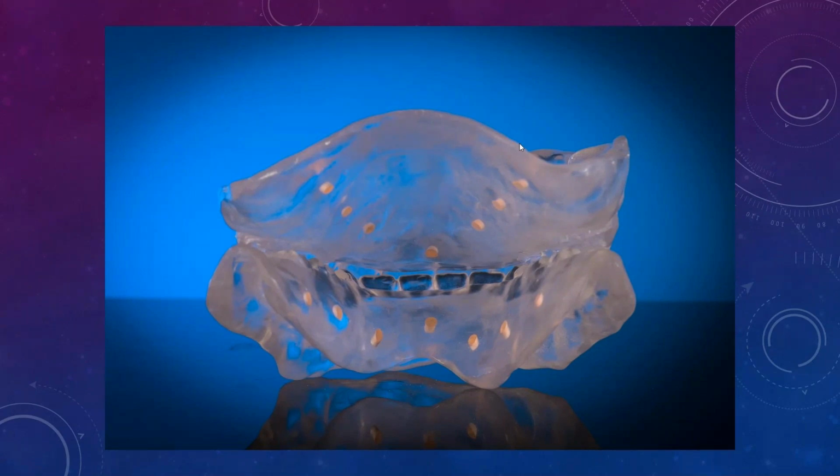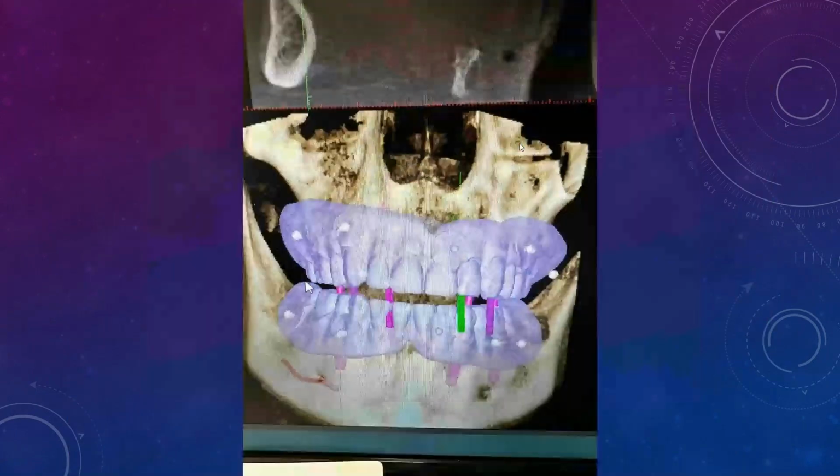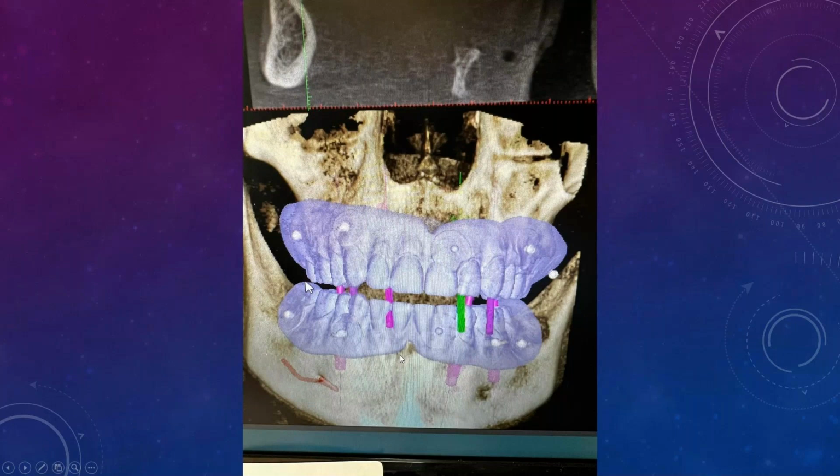And what it basically looks like is something like this. So you have your denture, and these are actually SureMark stickers that go in there. And we have the patient's mouth slightly open, just so we could see really well what's going on. A lot of times we'll put cotton between the dentures, and we'll put cotton on the sides so the tissue doesn't interfere as much. But this is what it typically looks like, guys.